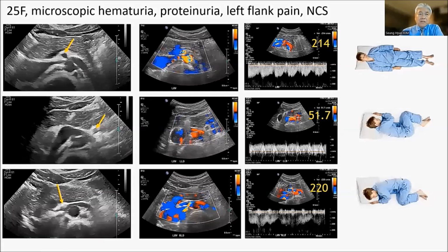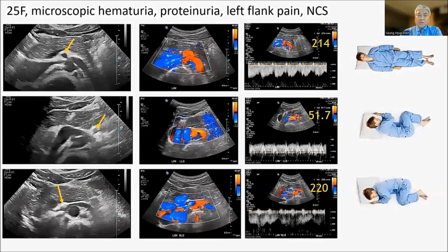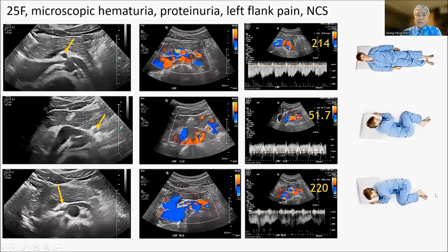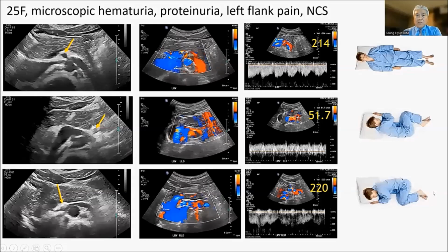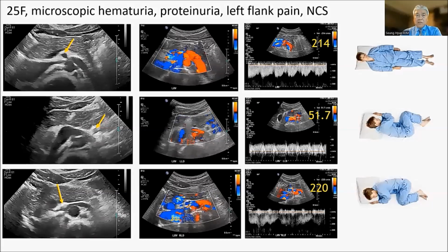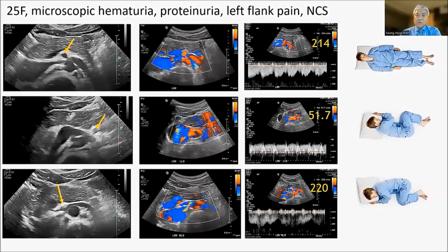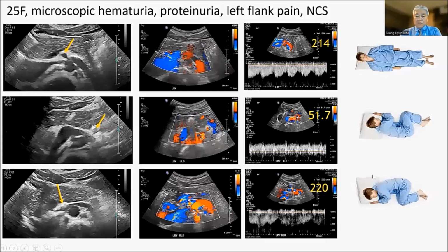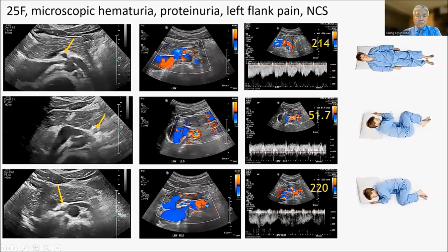She told me that her usual sleeping posture was right lateral decubitus, and I explained about the Nutcracker syndrome and the changes in Doppler findings with different postures, and recommended she change sleeping posture from right lateral decubitus to left lateral decubitus.